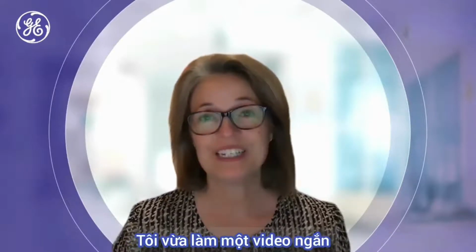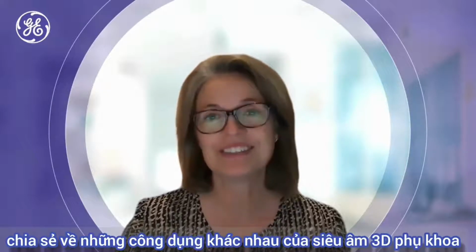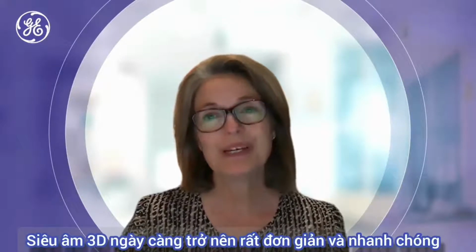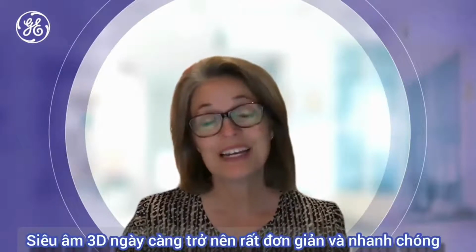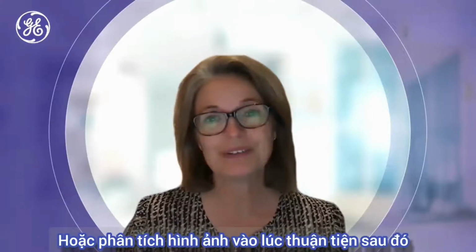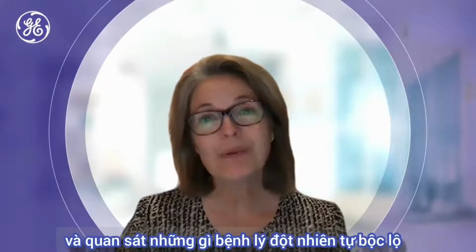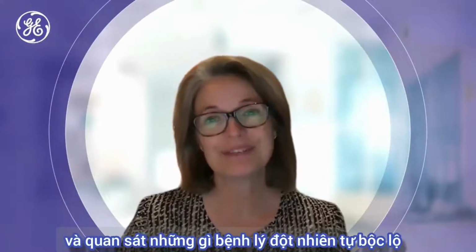I've made a short video demonstrating the various uses of 3D gynecology ultrasound in daily practice. Taking a 3D volume has become really quick and simple, and you can either look at the images immediately or manipulate them afterwards at your convenience. The main thing is just to have a go and see what pathology suddenly reveals itself.